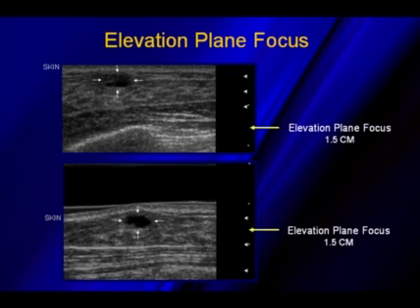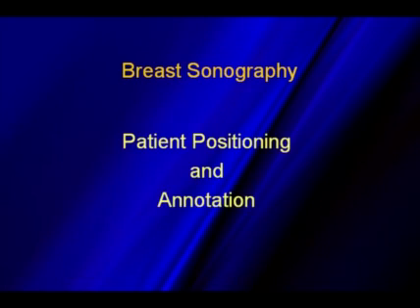Well, on ultrasound, we don't see structures that are running up towards the transducer very well. A 0-degree angle is our best angle for Doppler, but it's our worst angle for imaging. We see structures that are parallel to the transducer face, so something that's 90 degrees will cause a bright specular reflector, and we're going to see that a lot better on ultrasound, but if it's running straight towards us, we typically don't see it as well.